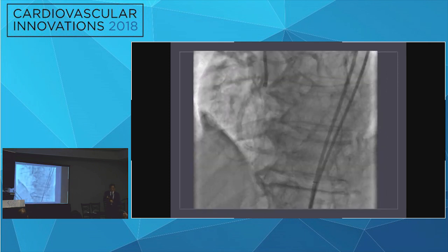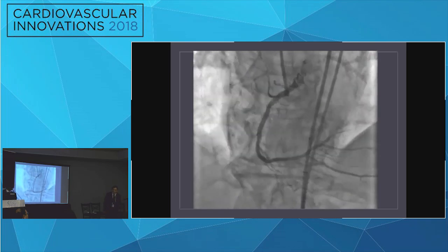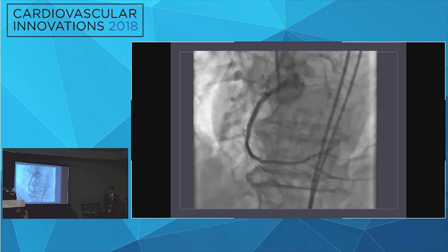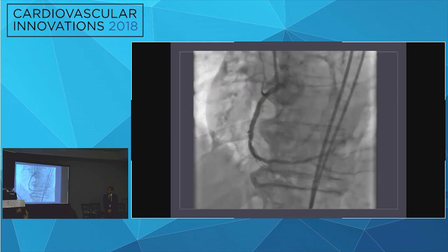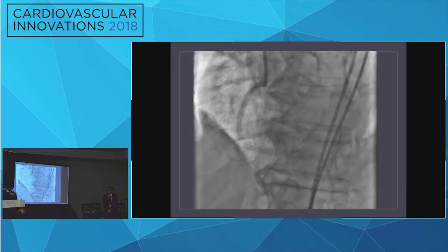Absolutely. So an alternative technique to snaring the wire is just to advance the wire into the guiding catheter and then wire the tip of a Corsair or microcatheter. We've done that a few times. I think it's called the rendezvous technique. So that's another possibility. Now, would you use IVUS or do additional imaging in this case?